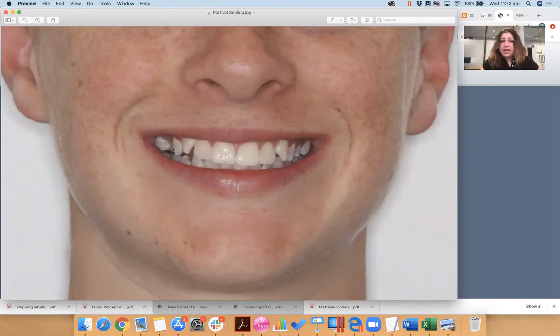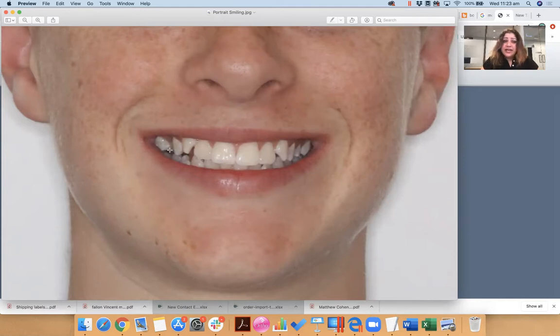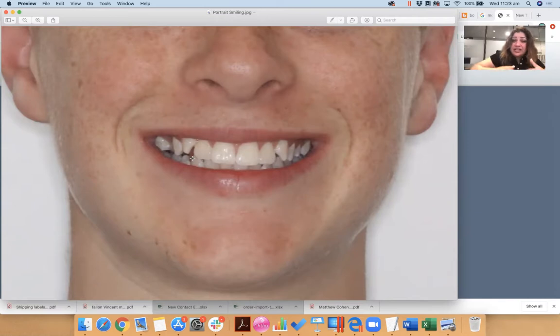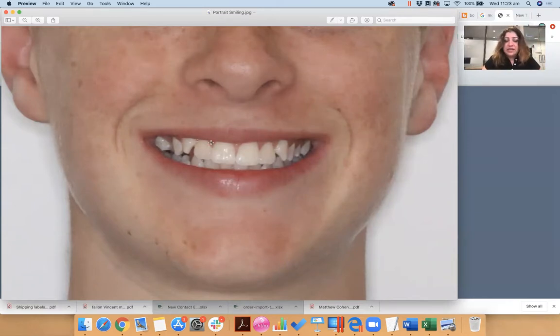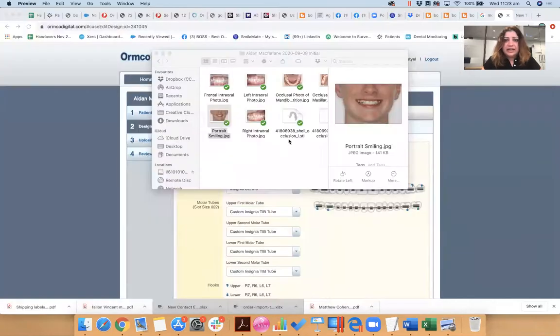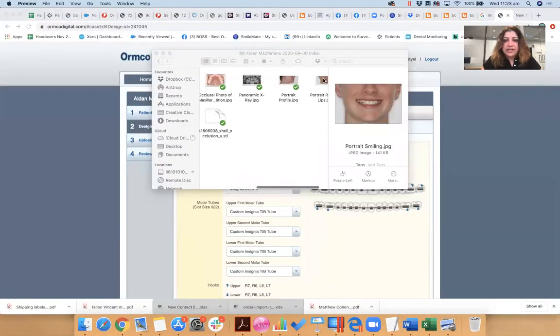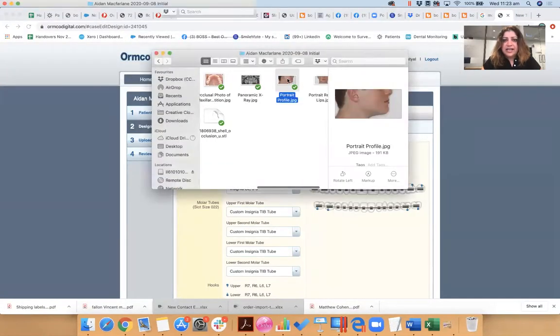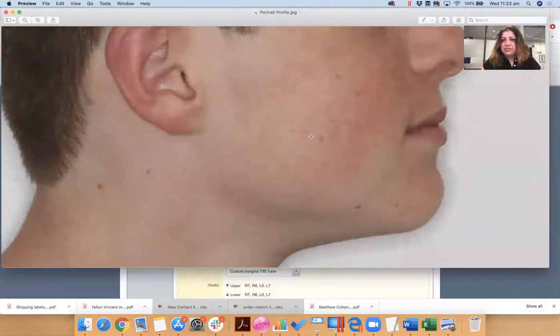He's obviously got a crossbite on the 1-5, okay? His upper right second premolar, we want to move it buccally. So we're going to tell the technician that, okay? Let's look at his other photos. So for example, if we look at his profile shot, he's a Class I case, so we're not going to really want to change his occlusion too much.